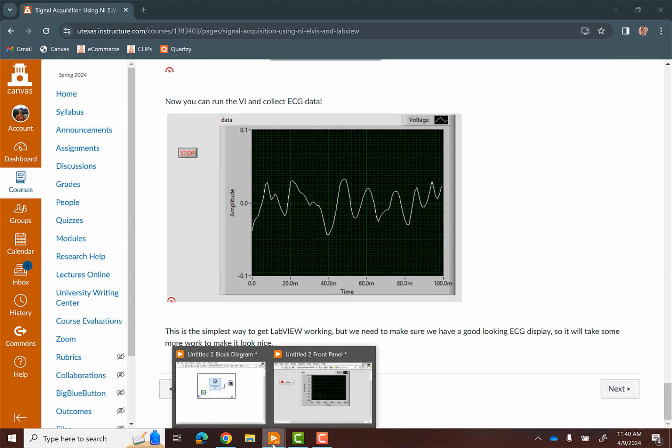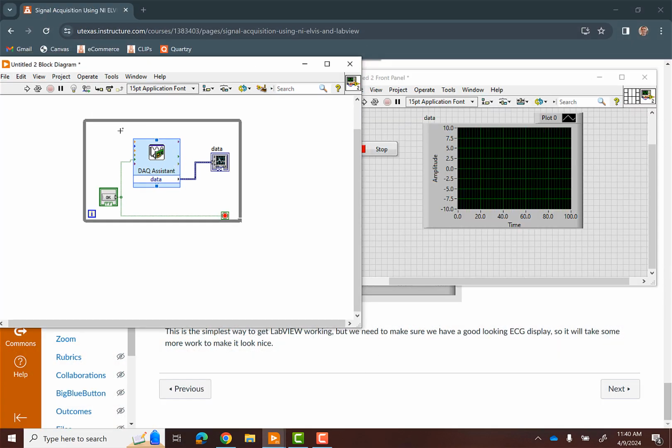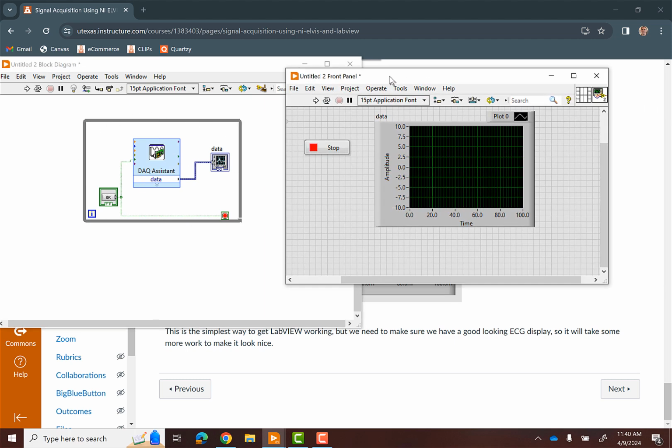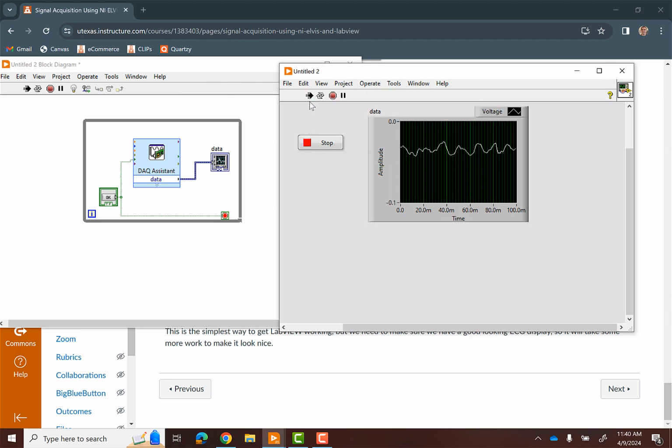And so I have done that already, okay, on here. And so I have my block diagram, which is the white thing, right? It shows us kind of how the program's running in the background. And then our front panel is the display itself. So I'm gonna make this a little bigger, run this, right? So my ECG is actually hooked up to there. And so you can kind of see my heart rate is kind of flashing by. And some of the ECG signals are flashing by, but this isn't a very pretty picture, right? So this is the simplest way we can at least check that we're getting some data in our analog inputs and we're happy with that.